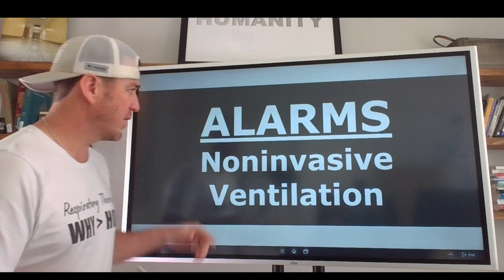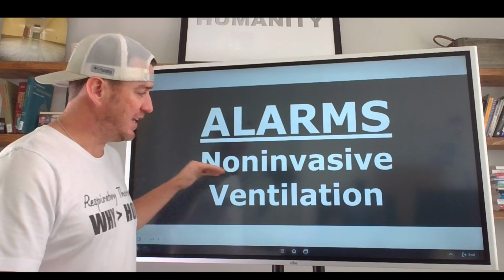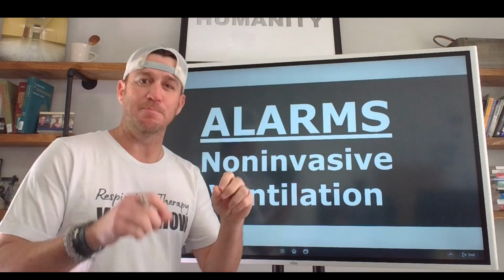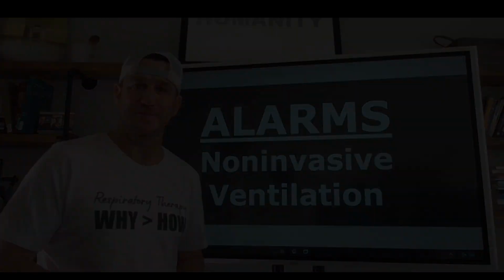Hey, in this video, we're going to be talking about alarms, but specifically the alarms associated with non-invasive ventilation. I'm going to tell you the two most commonly misunderstood alarms when it comes to non-invasive ventilation. Let's dive in.